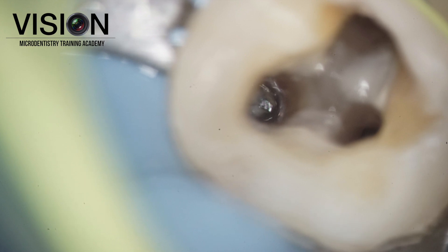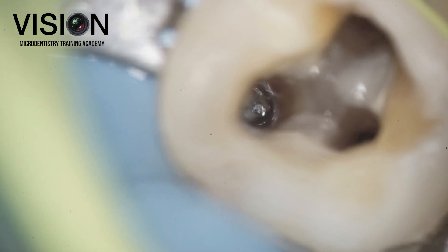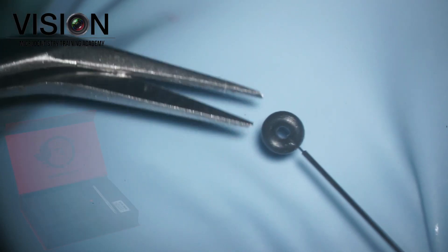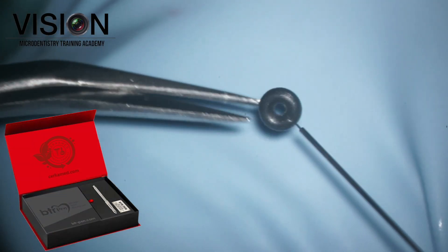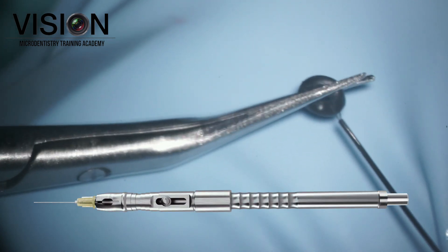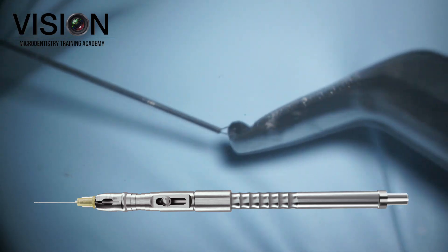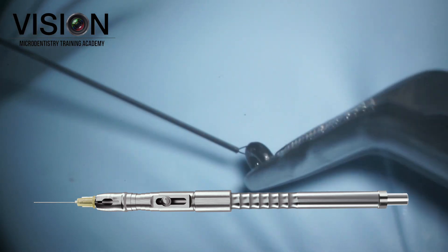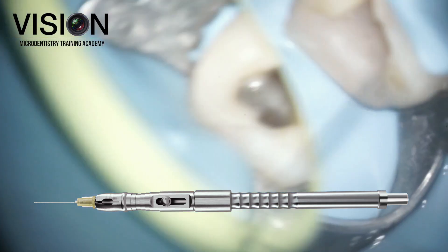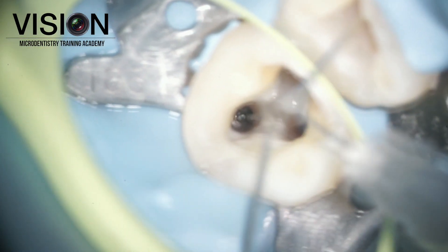Since the head of the fragment was exposed, I decided to use the BTR pen. It's a loop-based retrieval tool which makes use of a retrieval needle that forms a small loop around the head of the instrument. Right now I am cutting the small rubber which protects the loop on the retrieval needle. Once that is done, our loop is ready to be encircled around the head of the instrument.